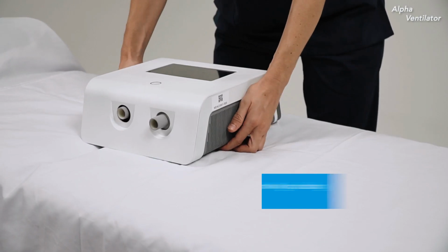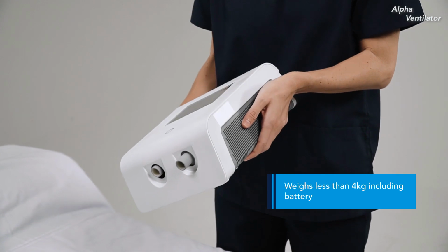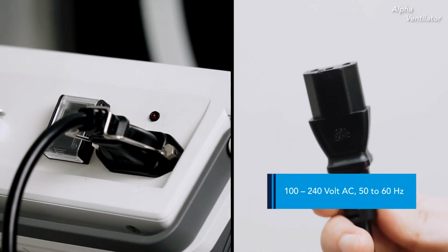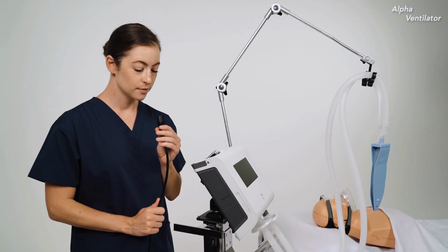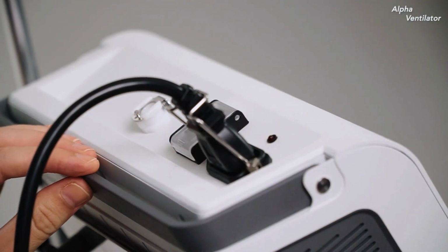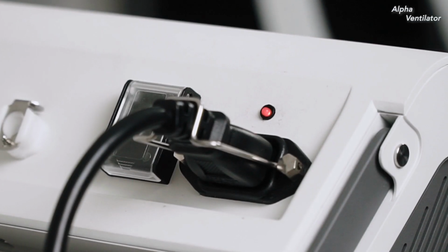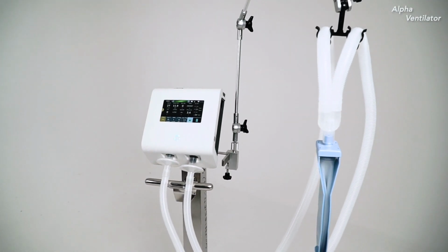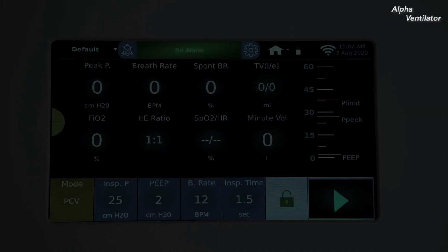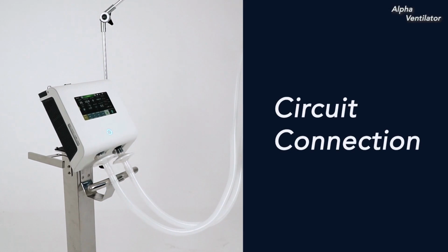The Alpha ventilator is highly portable and weighs less than 4 kilograms. It's powered using a 100 to 240 volt AC power supply. Connect the power cord to the AC inlet and secure with the retainer. A red LED will light up if the AC power is on. The ventilator also comes with a built-in lithium-ion battery, which can power the device for more than 2 hours.